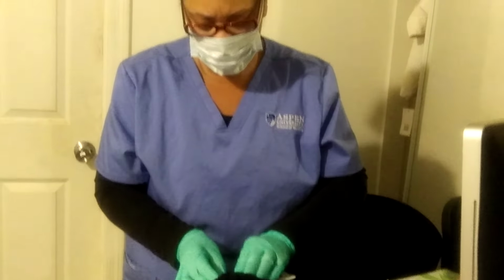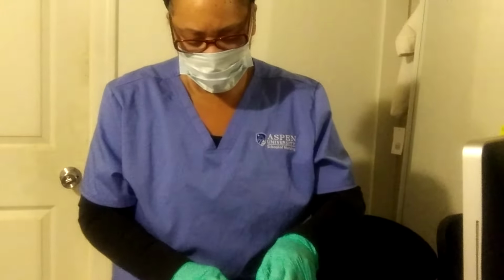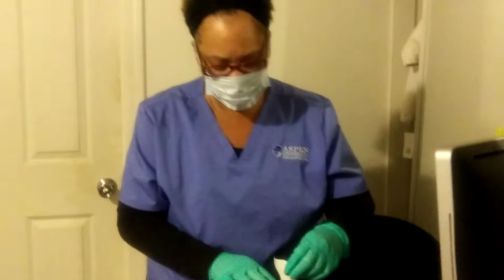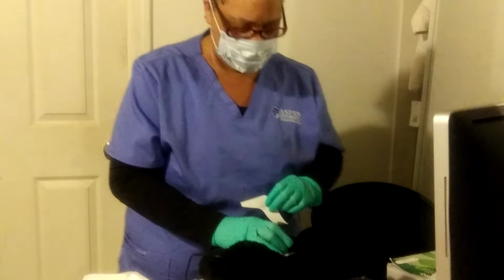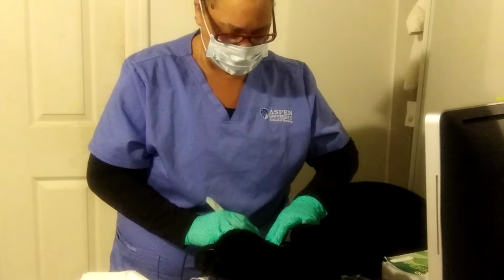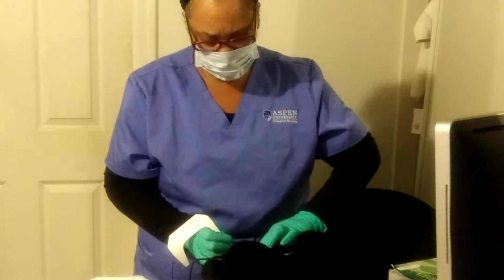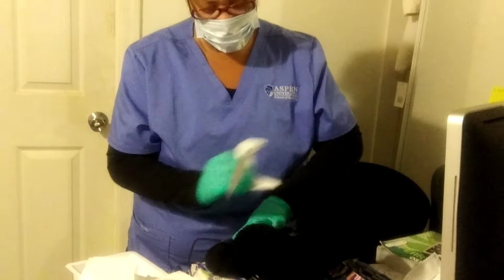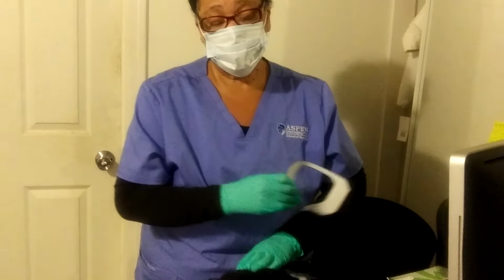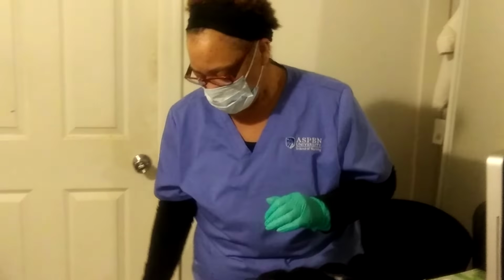And I start peeling the Tegaderm border off, and then make sure it adheres to the site. Pressing down as I remove it. As I'm doing this too, the patient's still sitting up and the head is turned the other way. Sometimes when we change them, we also put a mask on the patient.